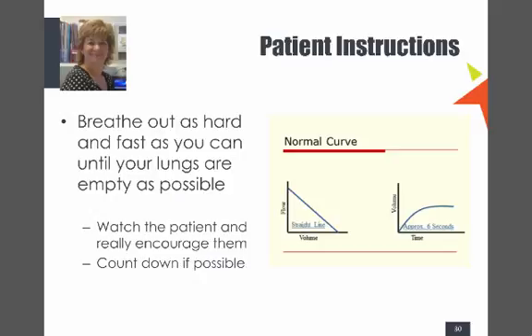But the big thing is you need to be getting the patient to breathe in as fully as they can. If we're wanting to measure volume, we really need a really big breath in and to blow out as fast as they can until their lungs are as empty as possible. So you get your patient to take a big breath in and then out, really going for it. And then you're saying, keep going, keep going, keep going. Go through about 6 seconds.